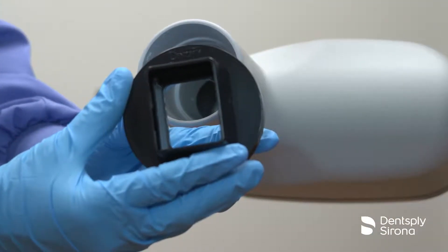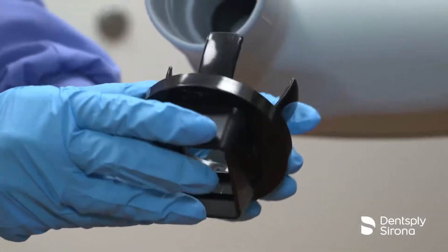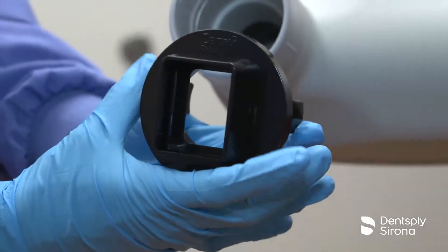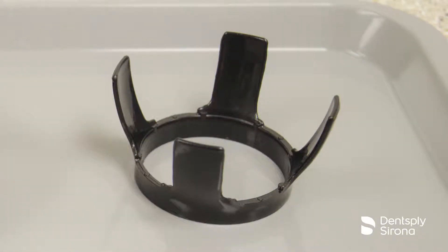The body of the RIN universal collimator includes a primary set of attachment legs, which secure the collimator to the positioning indicator device, or PID. The secondary set gives additional support and can be removed to accommodate a smaller PID.